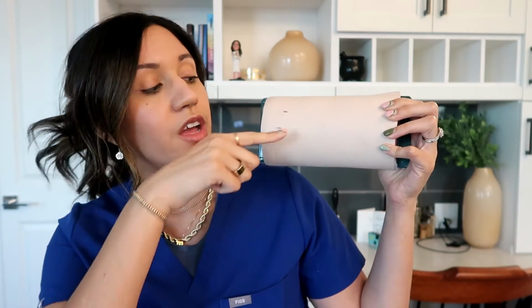I will clean off the area, usually with some betadine. That's just to clean off the skin. And next, before we actually place the Nexplanon, we do use numbing medication, or a local anesthetic, to numb the area. Typically, we use a medication called lidocaine, and this is just injected right underneath the skin. So we identify the area exactly where we want to place the Nexplanon, and we take that needle and inject that lidocaine underneath the skin.